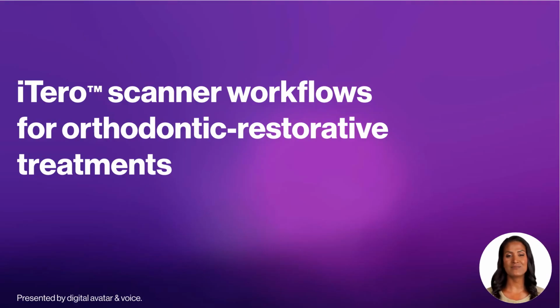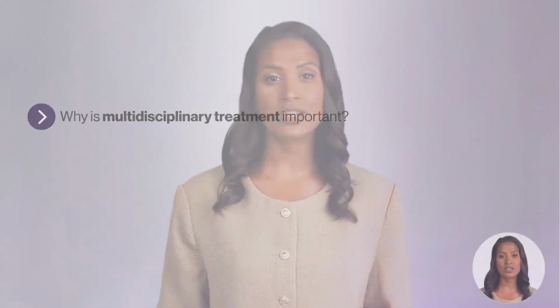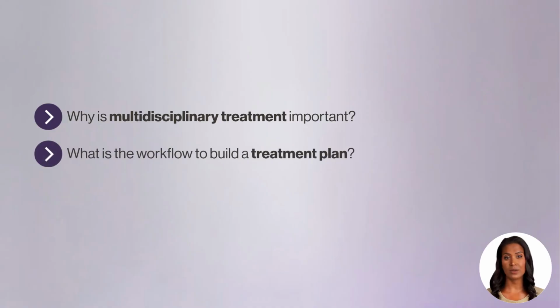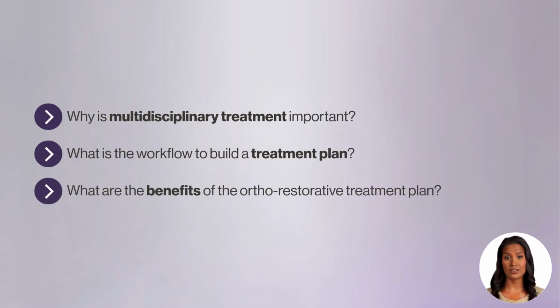As we delve into the modern era of digital dentistry, iTero intraoral scanners play a pivotal role in enhancing the efficiency of general dental practice and improving patient outcomes. In this unit, we will explore the value and benefits of the ortho-restorative treatment approach and understand why multidisciplinary treatment is important. What's the workflow to build a treatment plan involving orthodontic and restorative procedures, and what are its benefits?